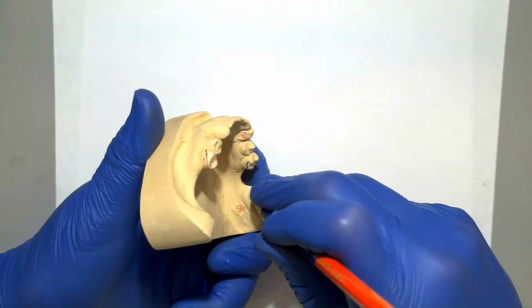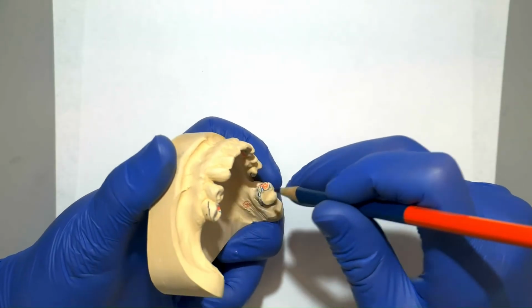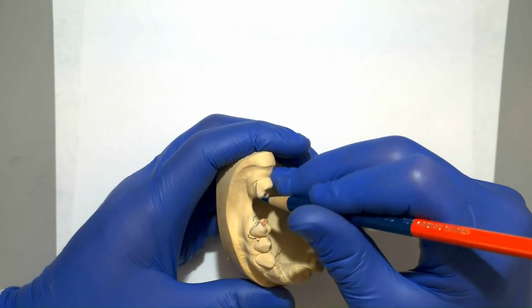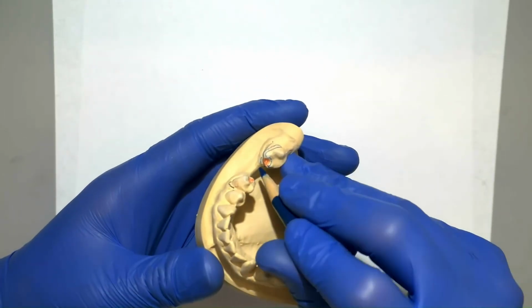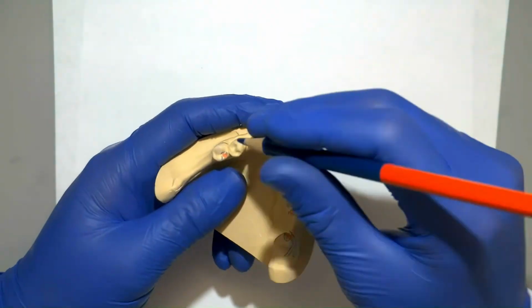making sure that the retentive clasp has only the tip under the survey line. The rest of the body stays occlusal to the survey line. And then the reciprocal arm on the other side, however, stays occlusal to the survey line for the entirety of its existence. Now we're going to go to the other side and cover up that guide plate and start the finish line going straight down with a little minor connector.